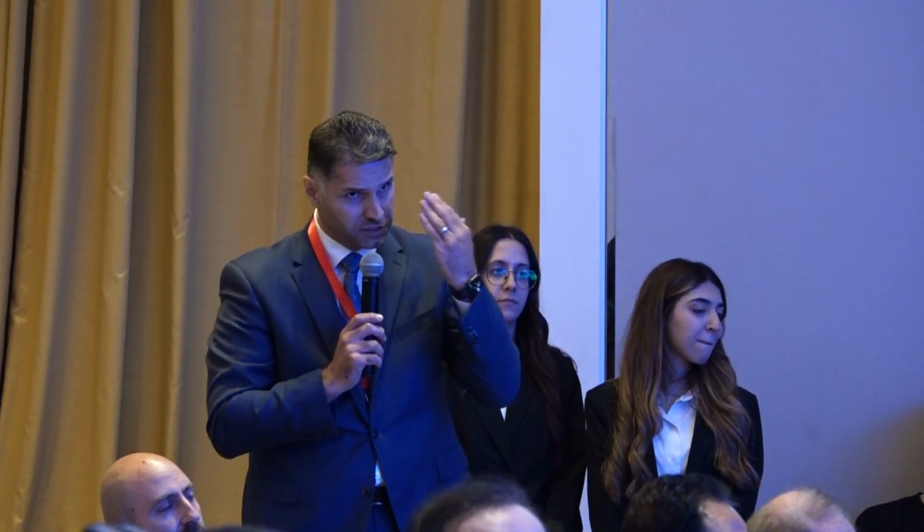Inshallah. The second point, and that's my personal approach, I like the rotablation in a virgin artery, not touched by balloons. I know many people say that you can do ballooning, and if there's no visible dissection, you can proceed with the rota. I've done it a few times, but yet I feel it's much safer to start with the rotablation on a very smooth calcium. You don't run into any entrapment or catching the dissection.